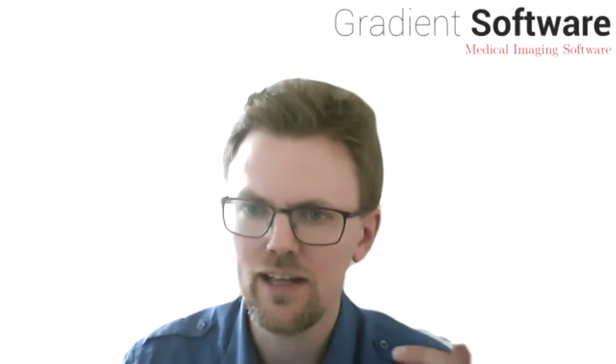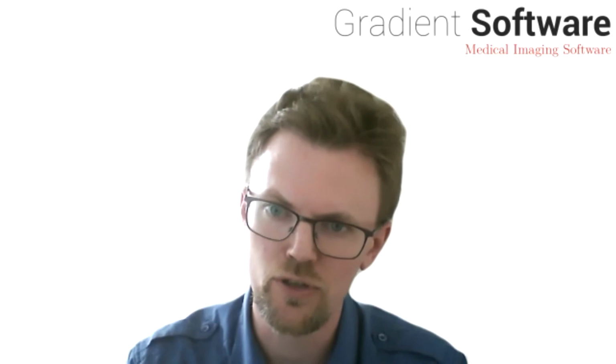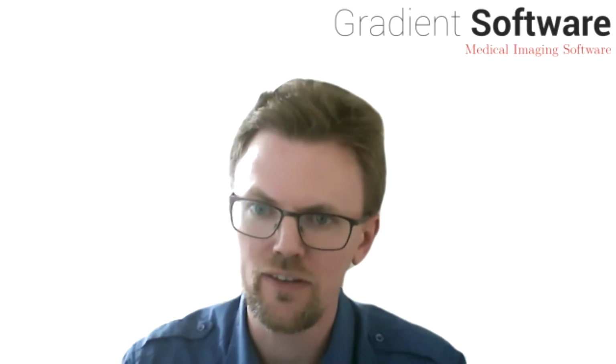Thank you both. That's very good answers. Thank you. I would like to add that ISMRMRD doesn't really support storing processed data except for images. I mean, you could store a B0 map as a complex image, but for other types of data, that's not possible. So typically you'd store the raw acquisitions that we use to produce that dependency rather than the processed dependency itself.